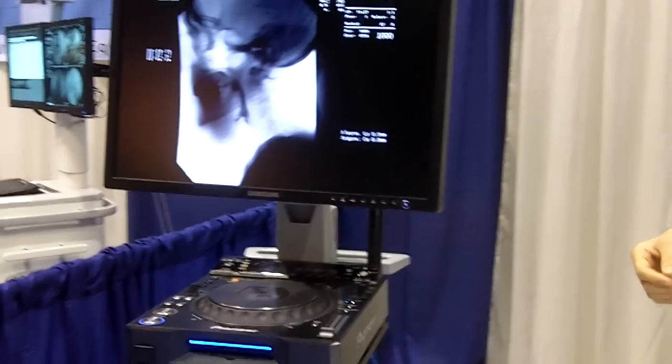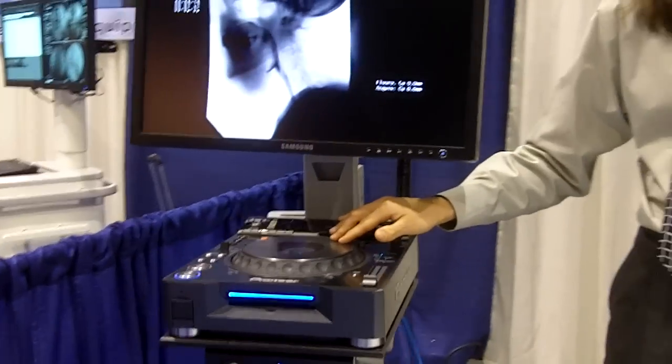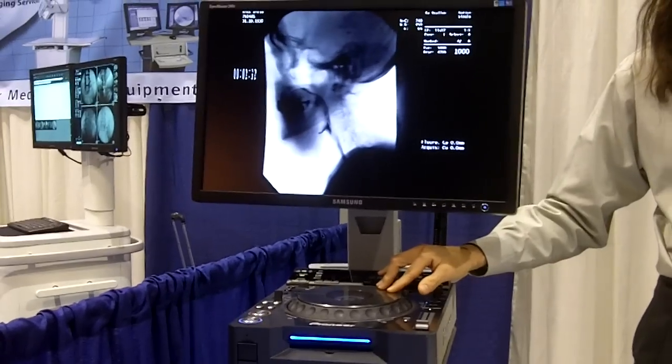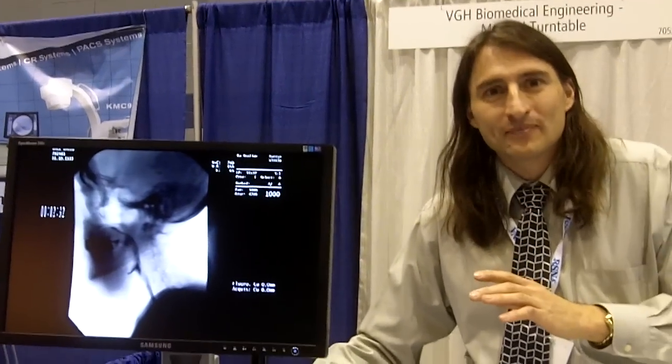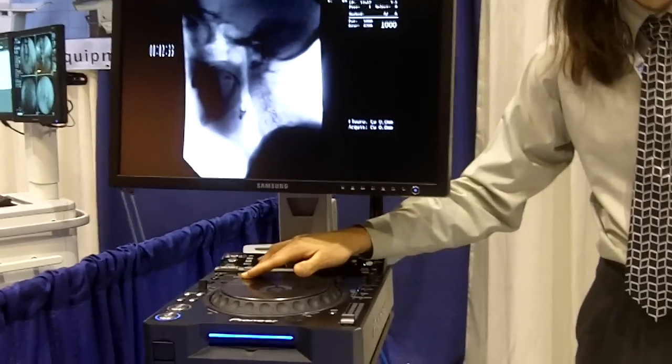I'm John Marquez, I work at Biomedical Engineering in Vancouver General Hospital in Vancouver, Canada. We're showing off what we call a medical turntable. The purpose of it is to review video within a hospital — a very low cost solution for being able to review video frame by frame. We're using it for fluoroscopy.